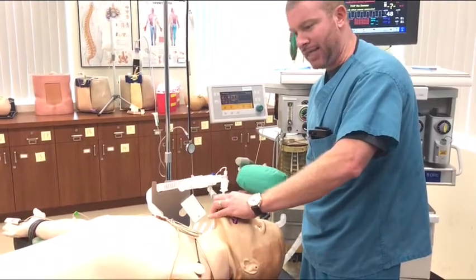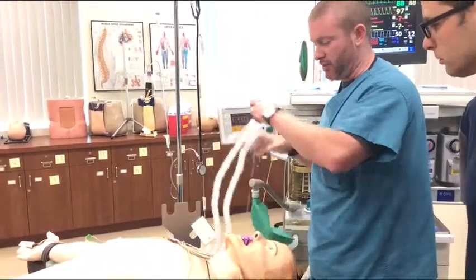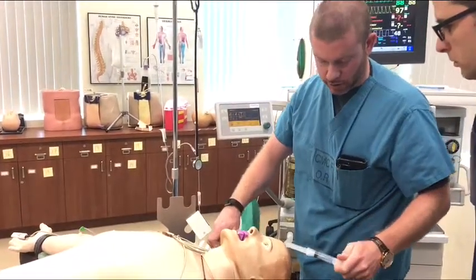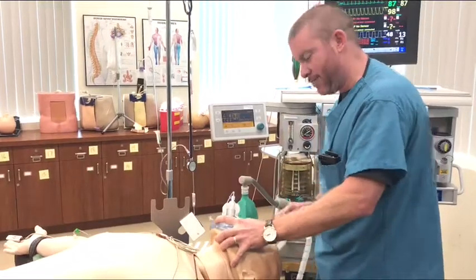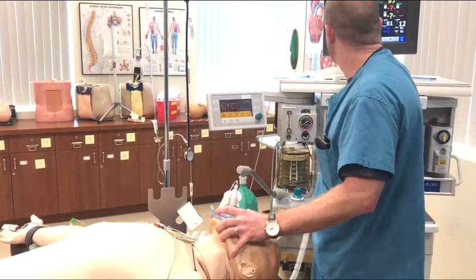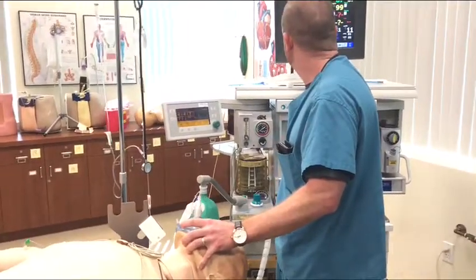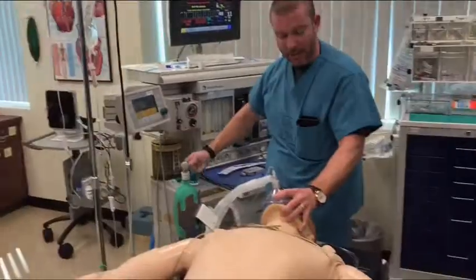Carlos, take a big deep breath. He initiates inspiration. He's full inspiration. I pull out as I give positive pressure. This is exactly how I do it. I'll set this right there. Carlos, take a big deep breath. What am I looking for, guys? Spontaneous. Right here. Do I have end tidal? I do have end tidal. So I can take my PEEP off.